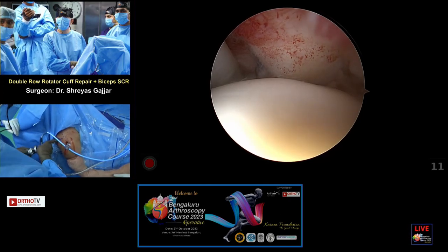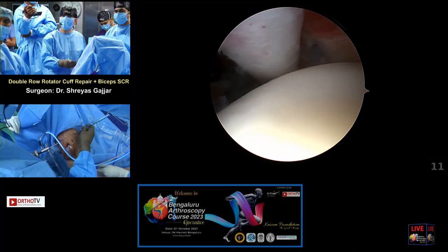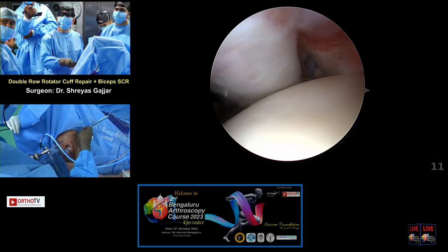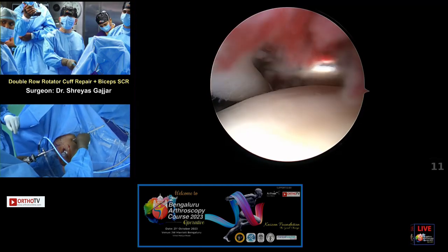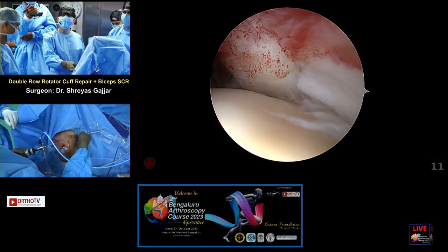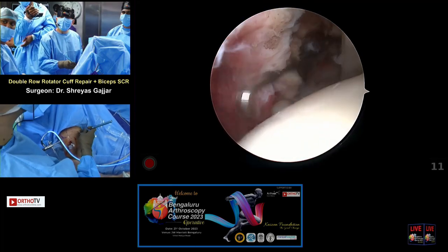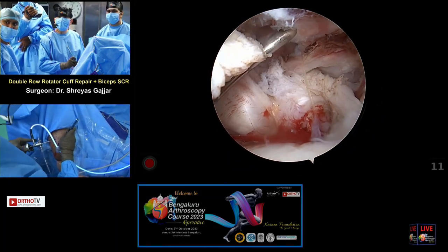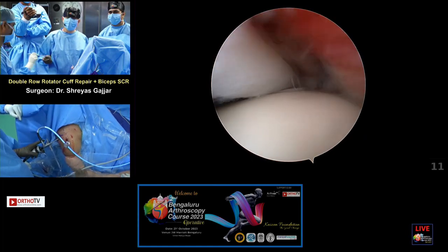Yes. Probe, please. So we've got the medial part of the cuff back onto the footprint. I don't think the biceps is quite far away. I don't see a concern here. And I'll just do the excursion. You see, this is all nice and smooth. And this is my repair. The footprint is back on here. So I'm quite happy with this. This is a watertight repair. And the subscap, if I may just show it again, that's the subscap repair here. So I'm not expecting any concern about impingement.